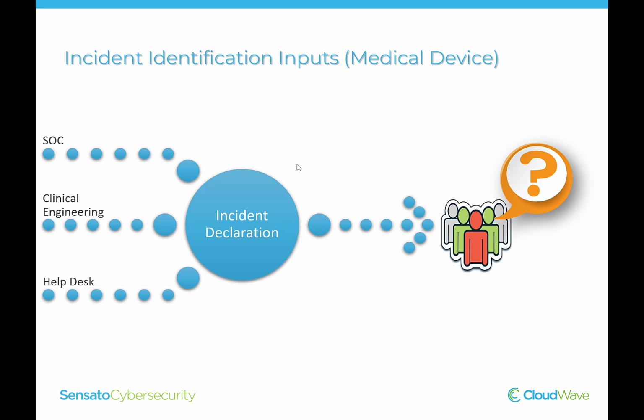If you put yourself in the shoes of the people that are the inputs here, whether they work for the SOC or clinical engineering or a help desk, they need to know what to say, what to ask the person reporting this incident. And we need to be able to do that rather quickly. And this is a real important thing.